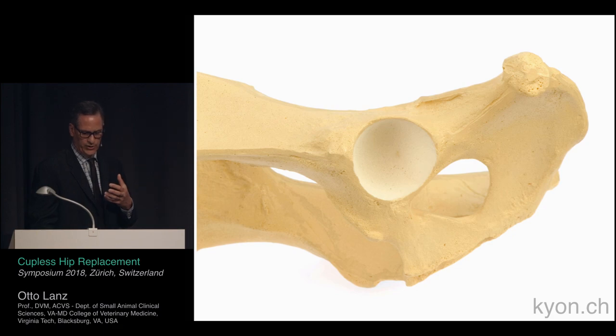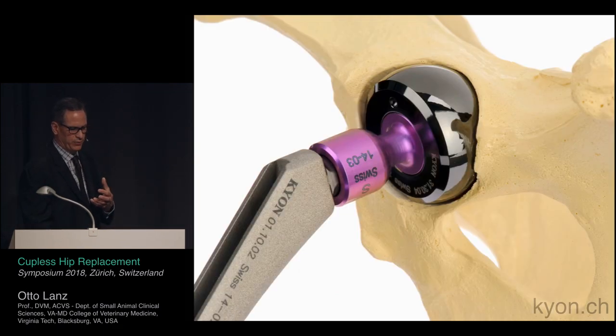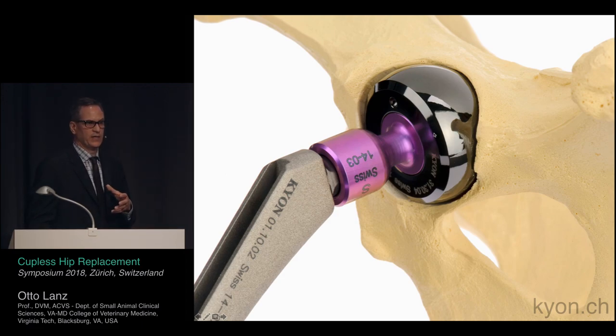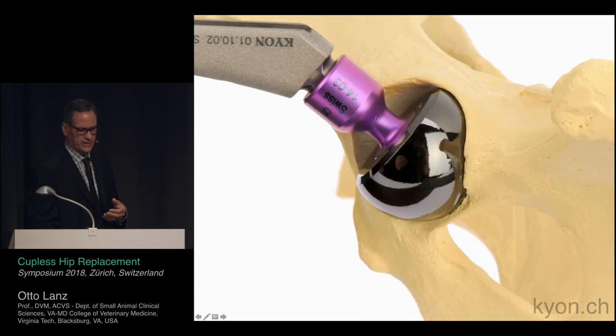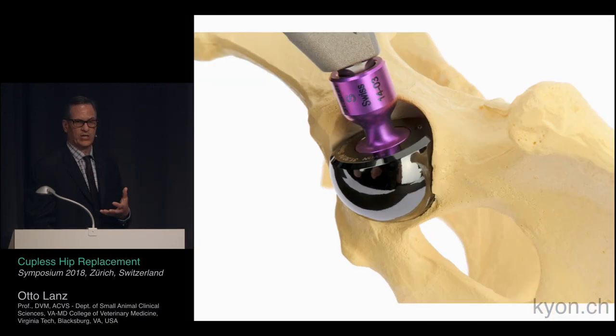With the neck implanted in a neutral position and the bigger head located in the acetabulum, the rate of impingement goes down. With decreased impingement, we should theoretically see a decreased amount of luxation in the postoperative period. The amount of flexion and extension needed before impingement occurs is greater than what most animals will normally undergo, and even with abduction of the limb, impingement is decreased quite a bit.